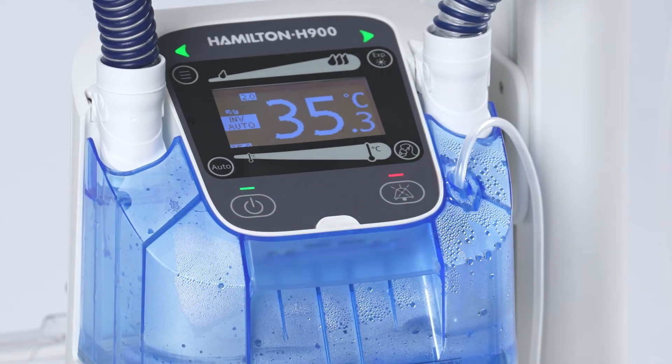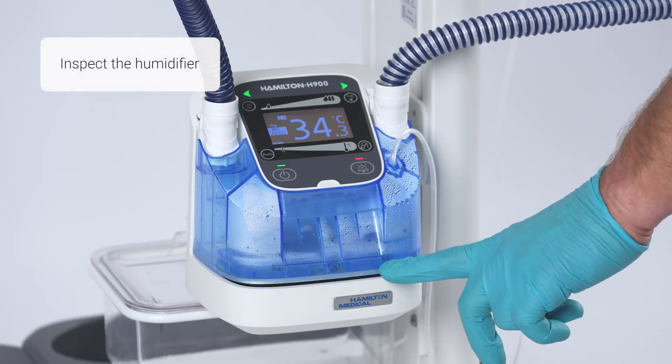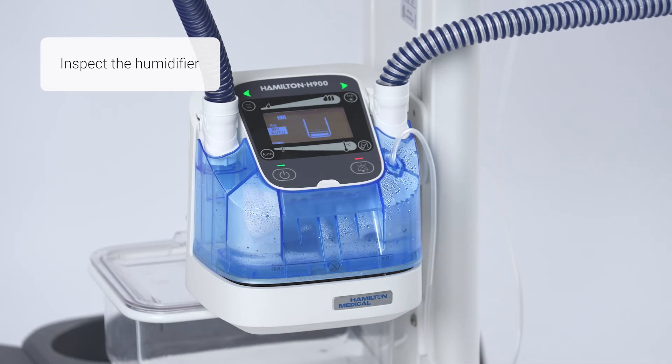There are a few actions you can take to avoid or resolve the issue. Check the water bag or bottle and tubing and make sure enough water is being supplied to the chamber, just below the fill line.